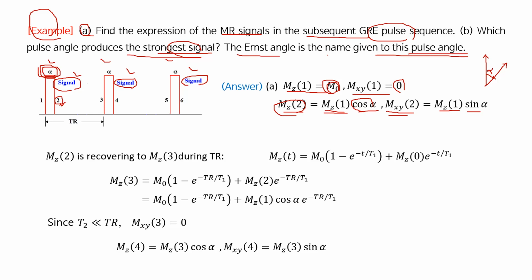And now at point 3 here, longitudinal magnetization is recovering, right? Recovering during time TR. The starting point is point 2, right? Point 2. So we have this relation.